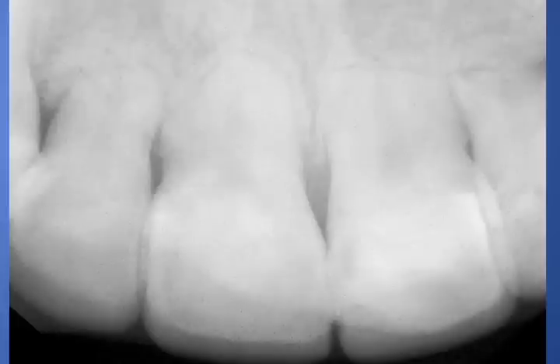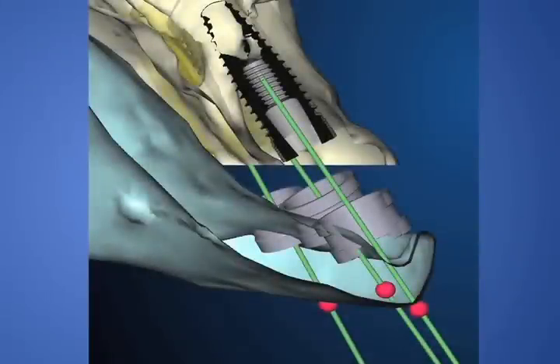You can see in this radiograph that the roots have shortened immensely, creating the mobility that our patient was most concerned with. As I mentioned earlier, we weren't necessarily concerned after extraction of those teeth to place implants in those socket sites because we would obliterate those sockets completely.